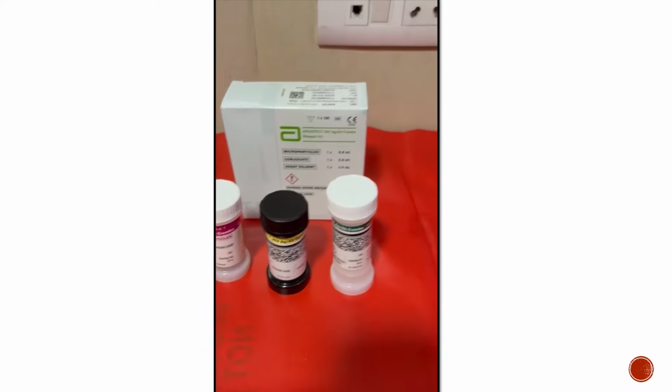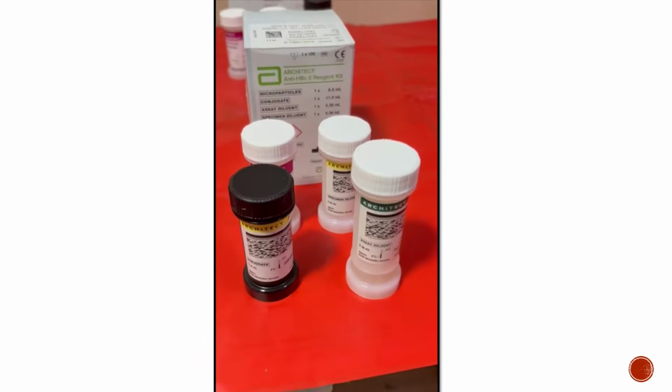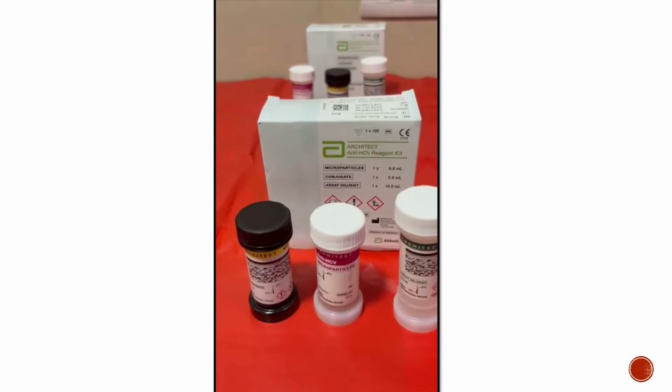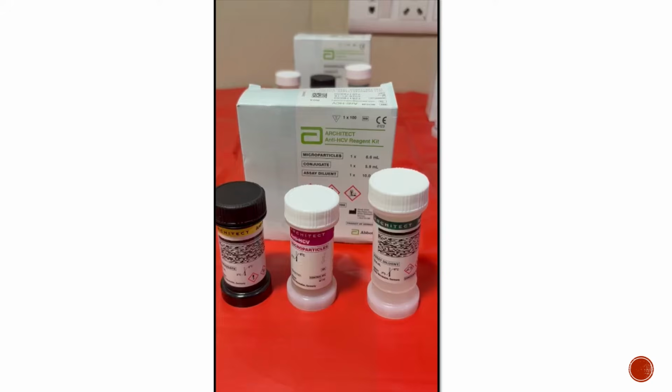These are the reagent kits for HIV, HBsAg, anti-HBc and for hepatitis C. Once these reagents are loaded in the system, they have a stability of 30 days.